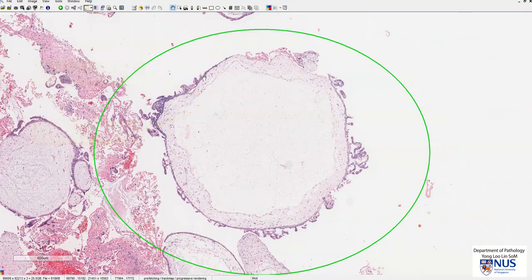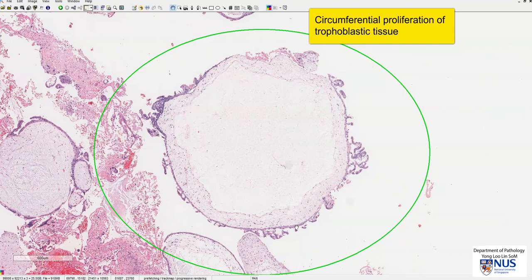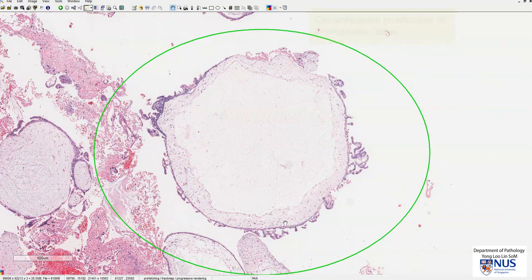Returning to the hydatidiform mole, we can see that there is proliferation of the trophoblast, and this proliferation is circumferential — meaning it is seen pretty much around the entire circumference of the villus. This circumferential proliferation of trophoblast is a feature of hydatidiform mole, as opposed to normal chorionic villi where trophoblast proliferation is only seen at one area or one pole of the villus.